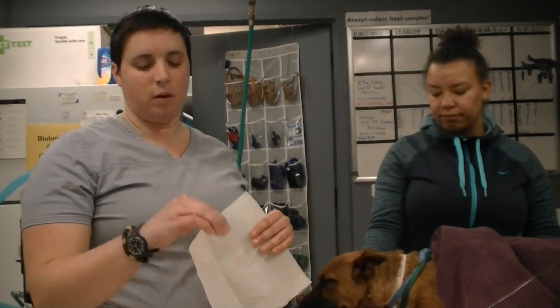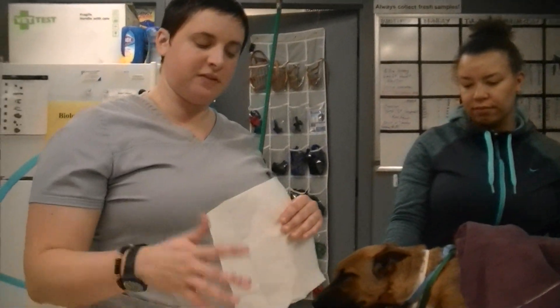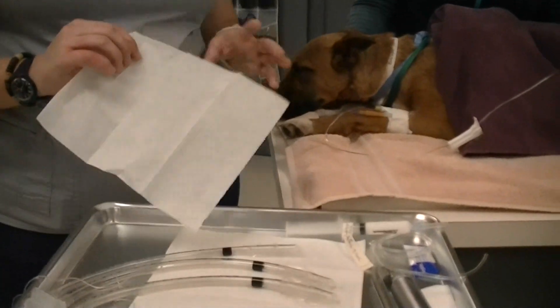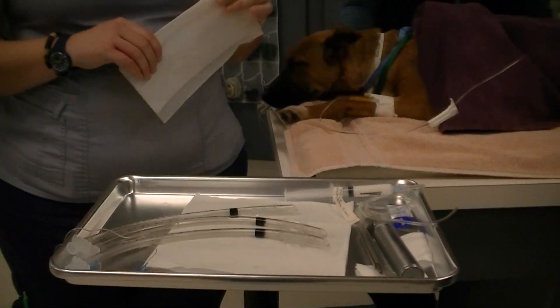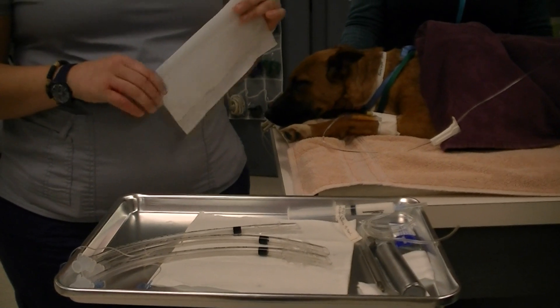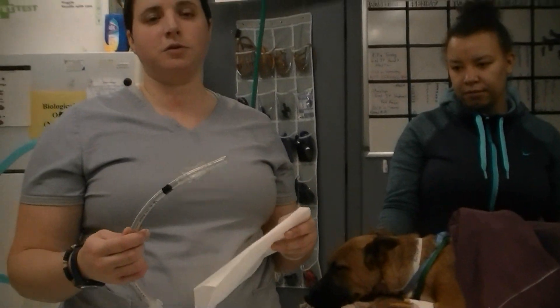You want to have one below and one above the size you think is going to work. I have already pressure checked them — I inflated the cuffs and let them sit for a little bit, kept them covered in paper towels so they don't get dirty. So now we need to decide which one is going to be the best. I'm going to start with the one I like, which is the eight, and I'm going to measure first for diameter.